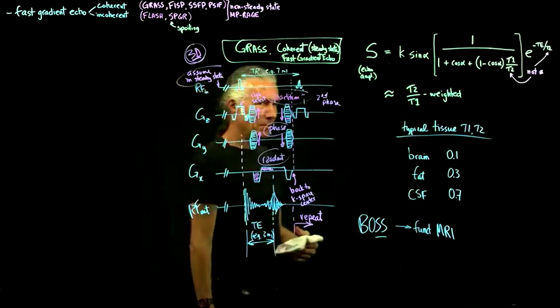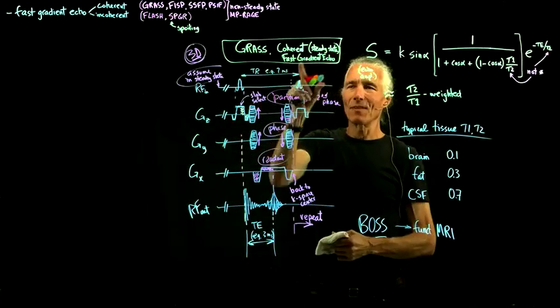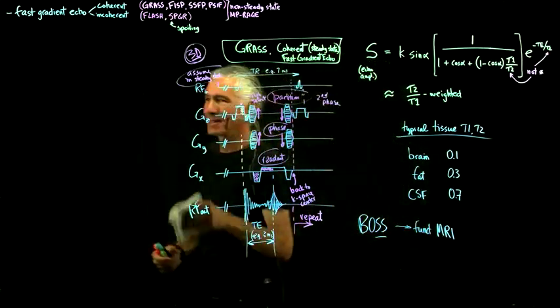Okay, so any questions about coherent steady state fast gradient echo grass?